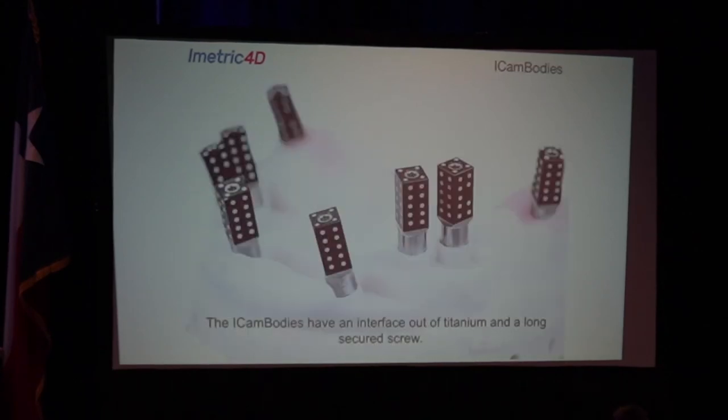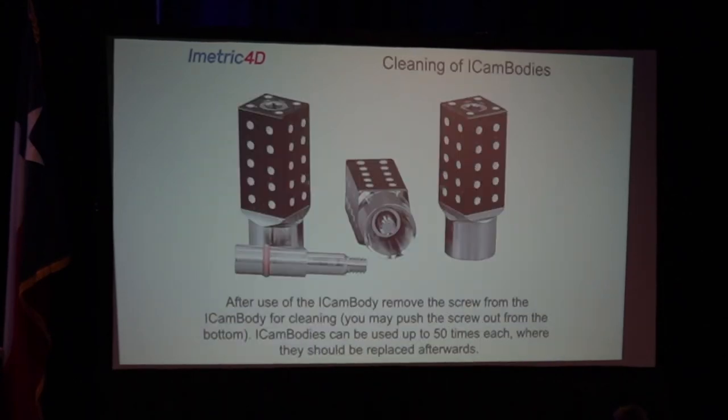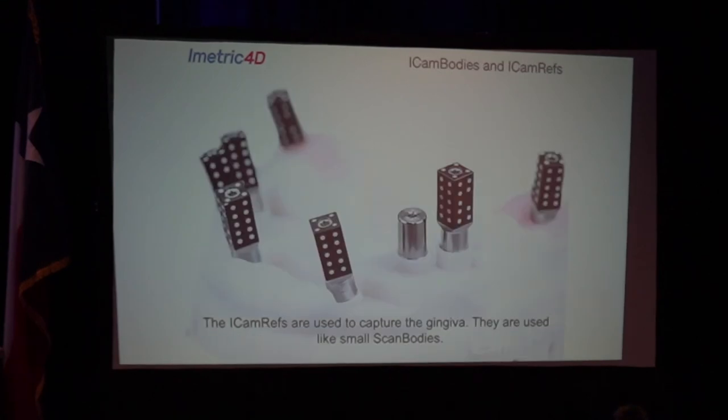And see, these are the iCam bodies. It has a titanium there, we've got to speed up now. So the silver cylinder, which we debated with him, I said, I have to sandblast them. But now he's going to start sending them out. I just got on a conference call with him earlier this week, just seeing what he's developing. I said, why didn't you sandblast them? He was like, oh, FDA didn't want sandblasted bodies. And I was like, but now they're going to start sandblasting because an intraoral scanner struggles with this.